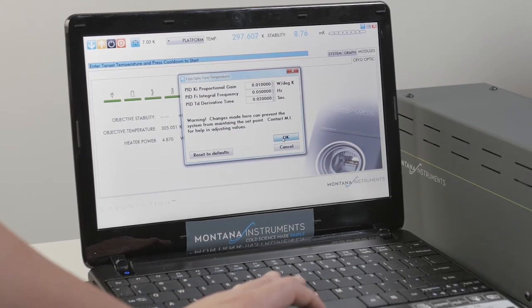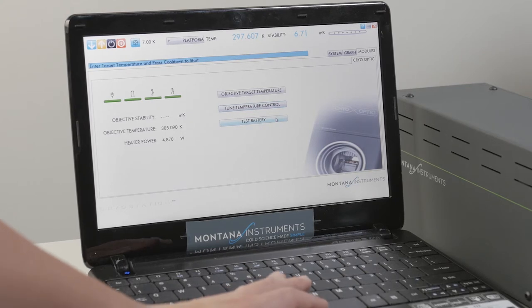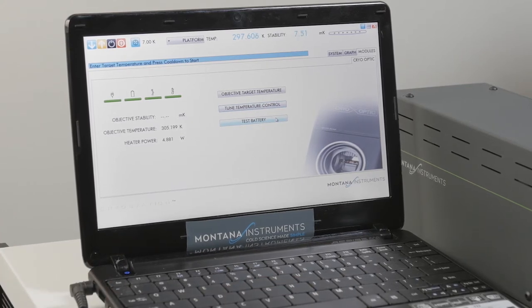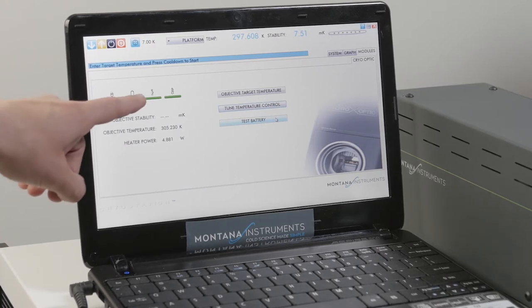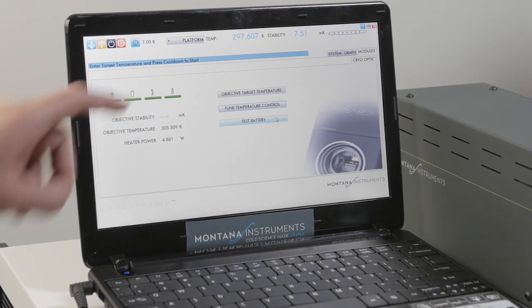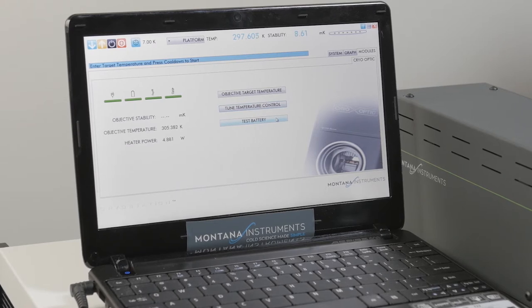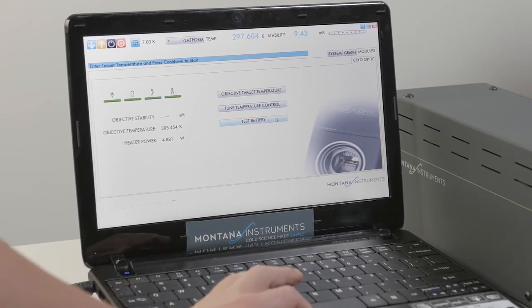Every three months the cryo-optic will say that you need to test the battery. In order to do so the battery needs to already be at full charge, showing a solid green, and then you can push that. But generally you don't really have to look at this screen to manipulate anything.